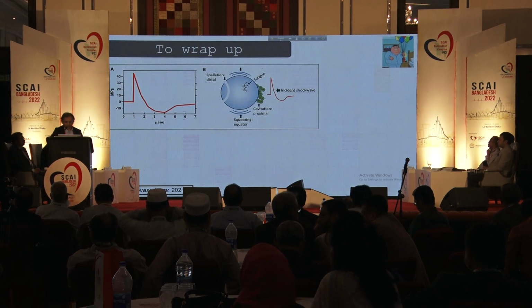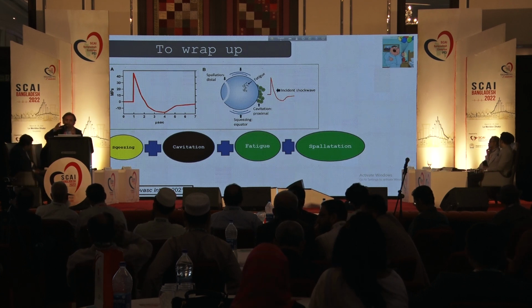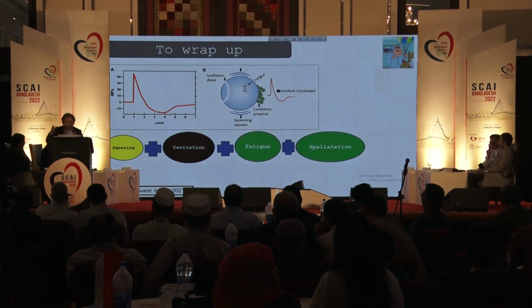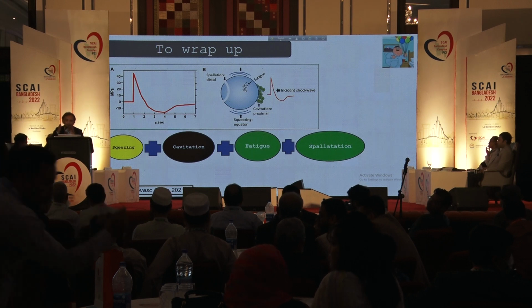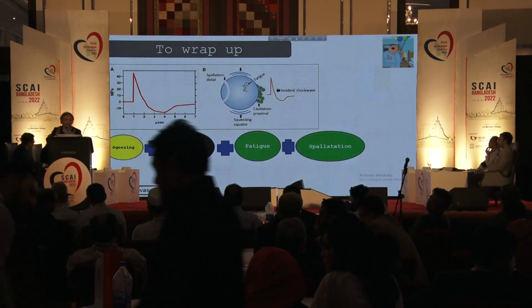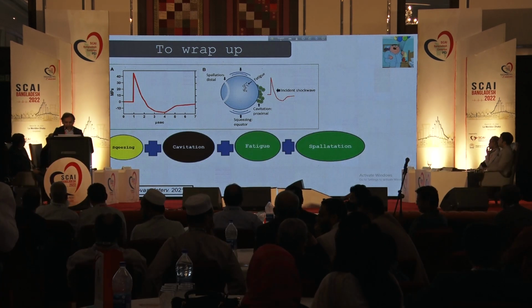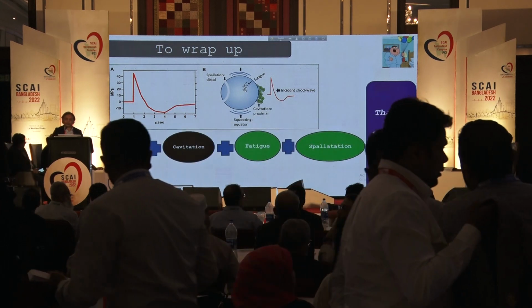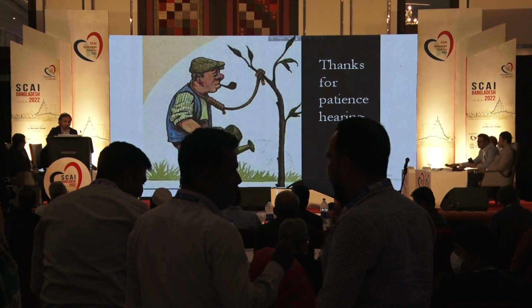So to wrap up, I can tell that the IVL has got some mechanism which the physicians need to know in physics. I don't know that much, but these are the terms: the IVL causes calcium breakdown by squeezing, then cavitation, then fatigue, and then spallation. And after that, calcium will be cracked. So that's the essence and the beauty of the IVL. Thank you very much. Thank you for your patience.